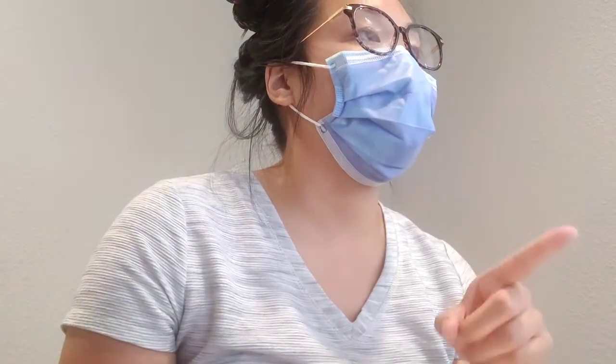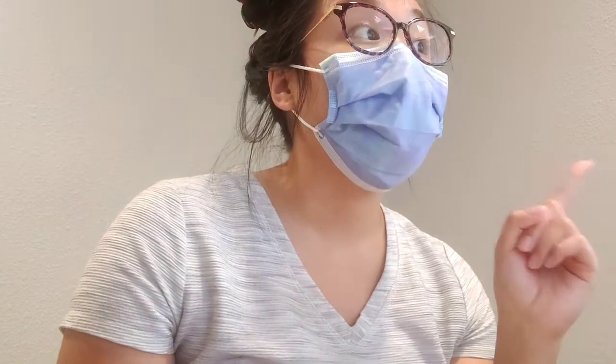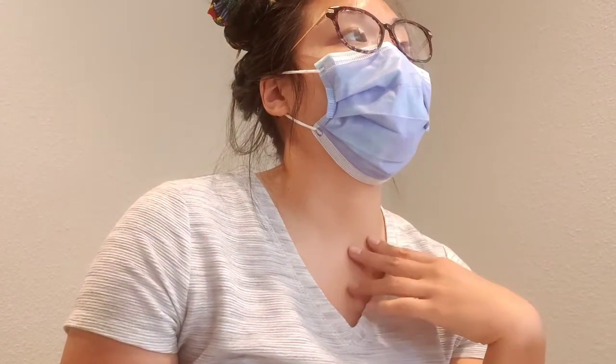The recommended slice thickness for a routine CT scan of the neck is blank millimeters. So it's very important to look at millimeters and centimeters. They keep changing this, and I just kept going through. So that's why I got it wrong, I think. The answer is 2.5 millimeters to 3 millimeters. That's what you want for the neck. I put 1.5 to 2.5.